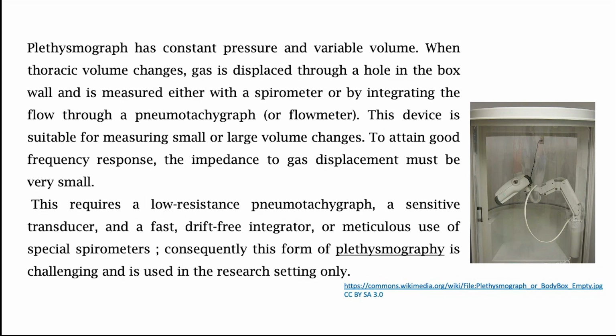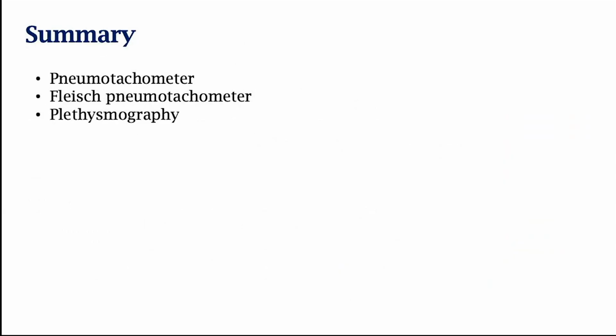So there are several challenges. Remember that, and the other thing is that not only lung volume, but gas compression, volume change in blood, even if you are talking while inside, all these things affect measurements. So it's a relatively serious, complicated procedure, but it measures the flow rate with relatively good accuracy.